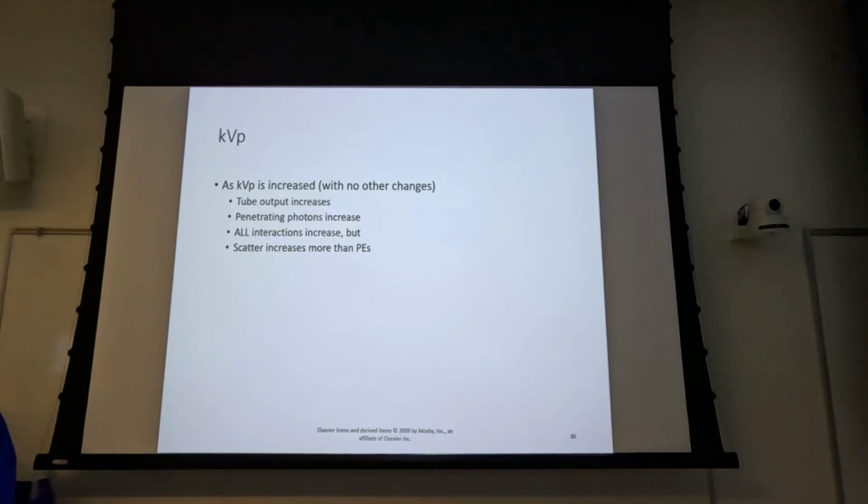Or you may get a true-false question. As KVP increases, all interactions increase. That's true. As KVP increases, you get less differential absorption, more penetration. Both of those would be true, right? So that may be a multiple choice where there's some, but not all of the above. You may get an all of the above, where it says Compton's increase, penetration increases, and photoelectrics increase.